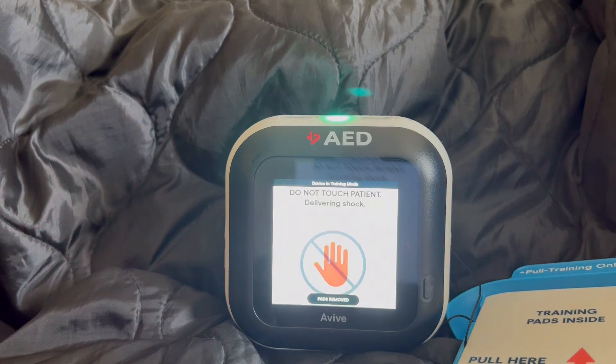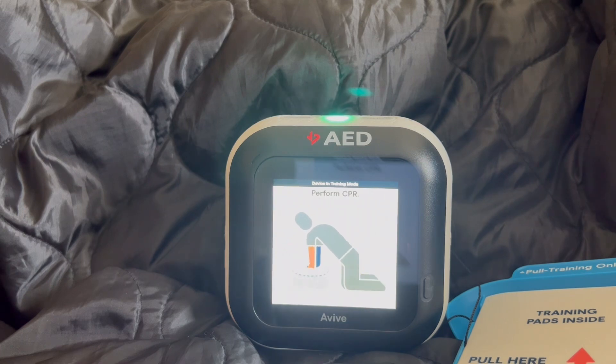Delivering shock in 3, 2, 1. Shock delivered. It is now safe to touch the patient.